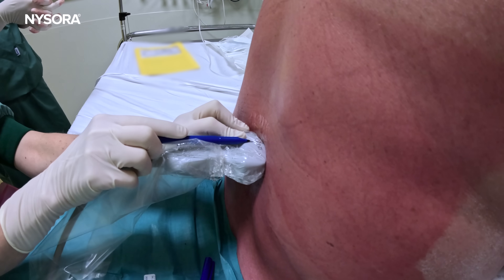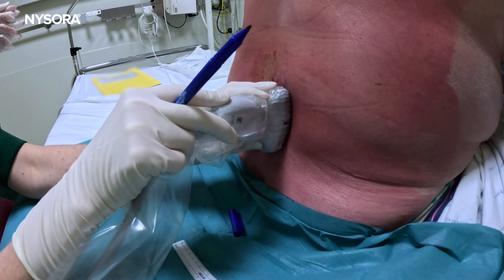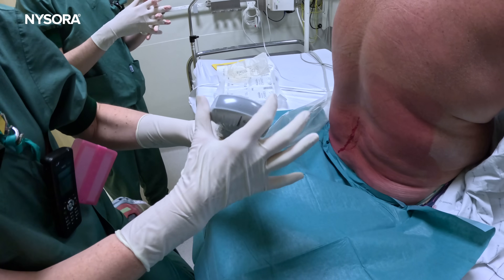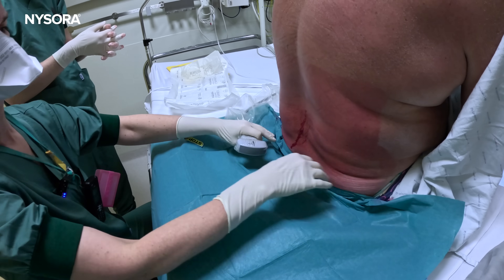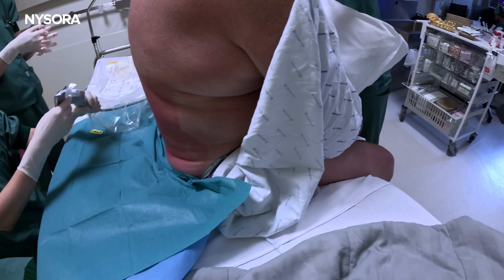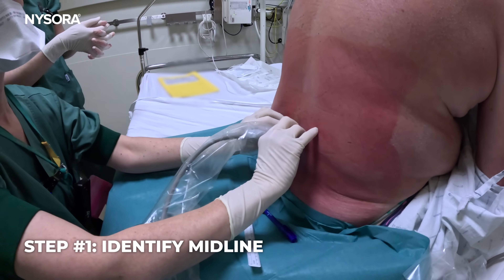In our practice, we use it for predicted difficult patients to determine the midline, the level of spinal anesthesia, and the depth at which we anticipate CSF return. We're going to place the sterile drape as low as we can, then put a bit of gel on the transducer, and first assess the level and try to find the spinous processes.